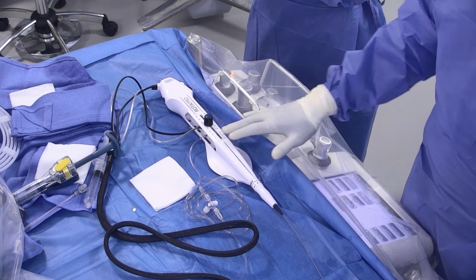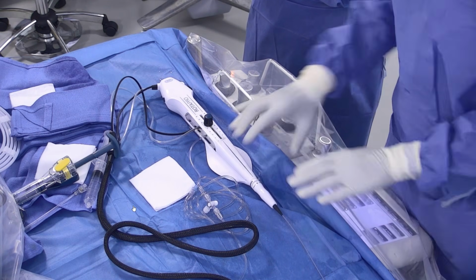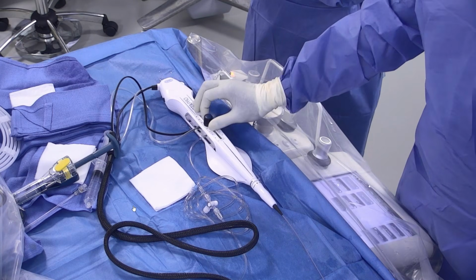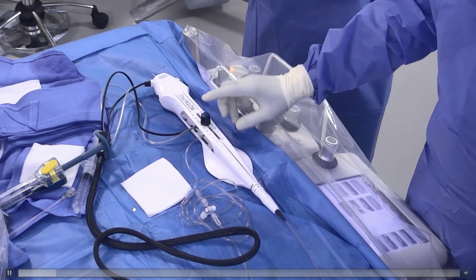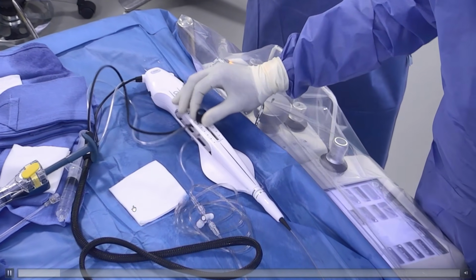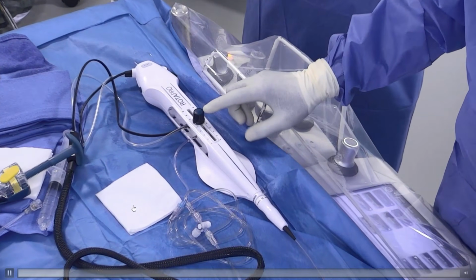What you see on screen, here we have the burr that didn't change at all, but it's more about the turbine that is a little bit different. We have the advancement and retraction knob that houses at the same time the on-off button for the rotation. We may advance and retract as we did in the past, but on top of that, you can see that blue button.